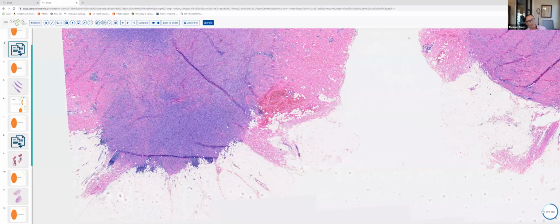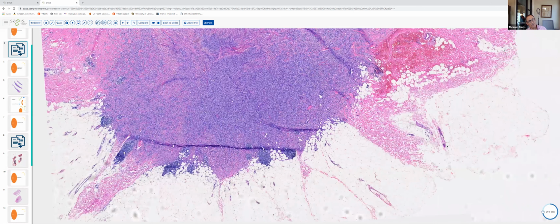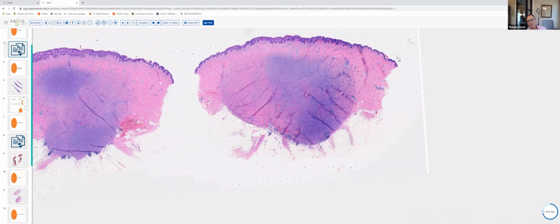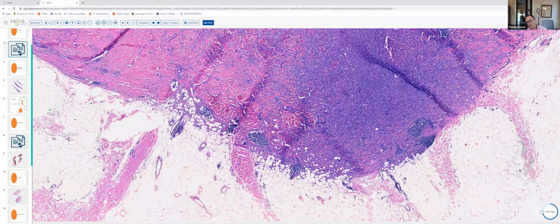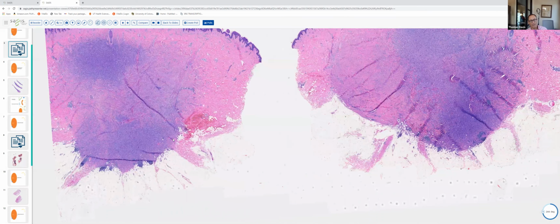With a deep dermatofibroma, the constituent cells, this fibrohistiocytic proliferation, tend to expand the fibrous septae in a radial fashion. In addition, the tumor will frequently compress the fat lobules, so it's got this pushing border. You can see in this particular example too, we've got these lymphoid aggregates at the dermal subcutaneous junction. They're commonly seen in deep dermatofibromas with extension into the fat, especially at the dermal subcutaneous junction.